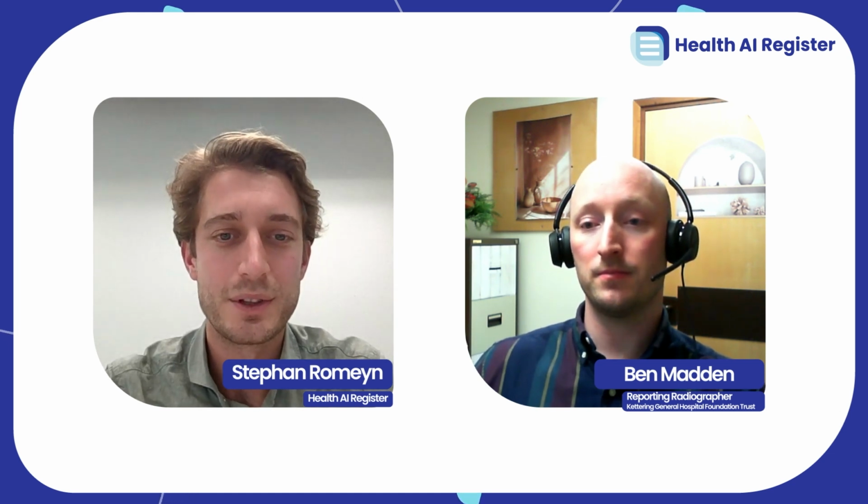So to really have this AI team on site with the different backgrounds from clinical, technical, regulatory to really drive the process forward. Really interesting insights.